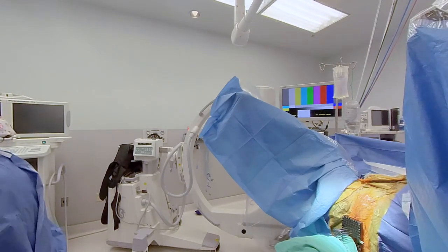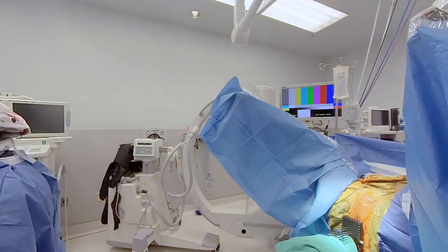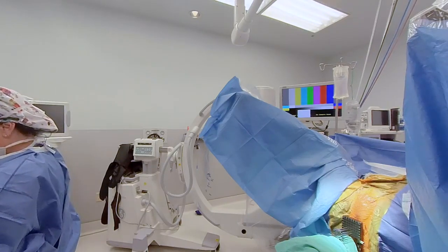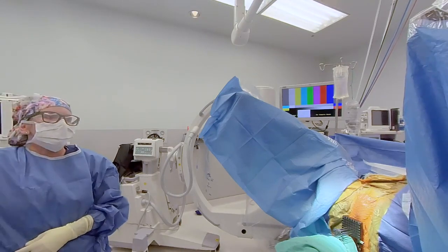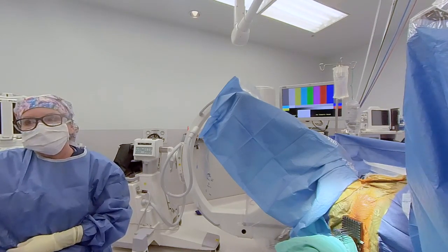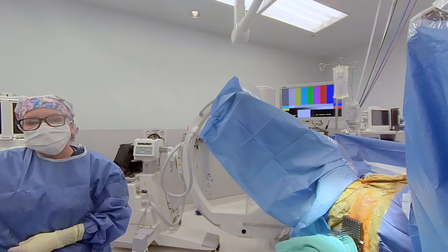So now we've cooled down the V150 prostate, and looking at the plan, all of our dose objectives have been met. The V150 urethra is nearly zero. The V125 urethral dose is less than 20%. And we were able to get a V150 below 60% with a V100 of 98%. We've met all of our objectives, and then we're going to review one more time. Again, I like to limit dose to the outer edges of the gland and have the dose pushed in, and we're ready to implant.